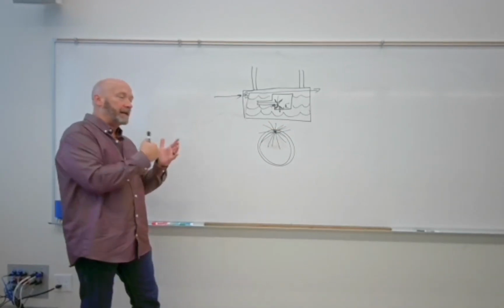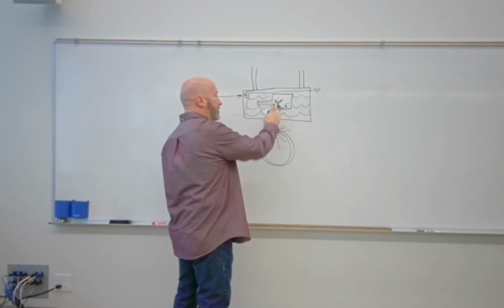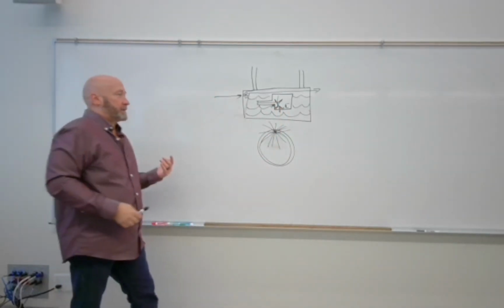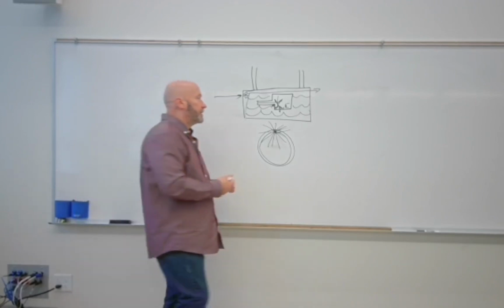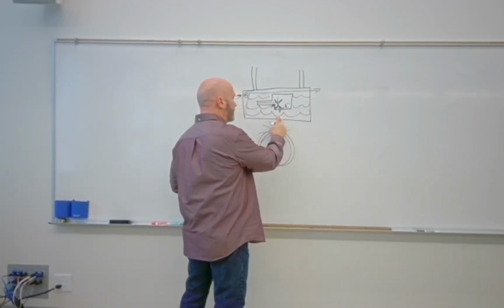Realistically, the X-rays that are trying to go straight through the anode are going to have a hard time because it's going to be heavy metal. So they're going to have a hard time going through it. But at the point of impact, you've got isotropic emissions. The X-ray tube itself has what we refer to as a window.